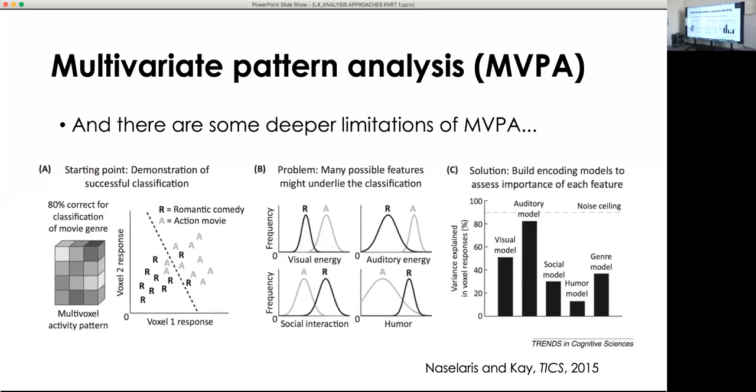So let's link that with this effect size thing. What the data told you was V1 was 95%. But you can pose this as, well, was it a simple RF coil issue? Then you have to do additional analyses to control for that. The MR signal is detected in the coils and they have a drop off in sensitivity. If you put the coil near the brain region V1, it's going to have better data. The tSNR will be higher, things like that. So you get 99% in V1, you get 80% in MT. You could say, well, is this a simple artifact of V1 happening to be closer to your coil? And then you can do analyses that answer that question.